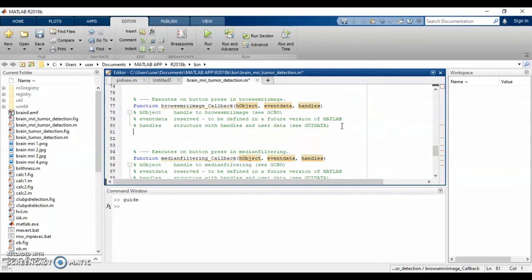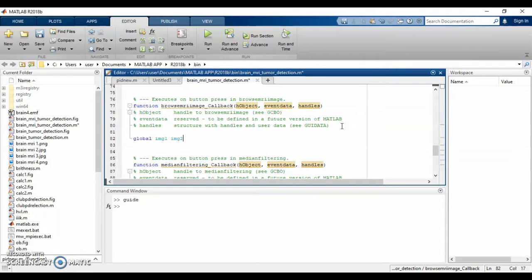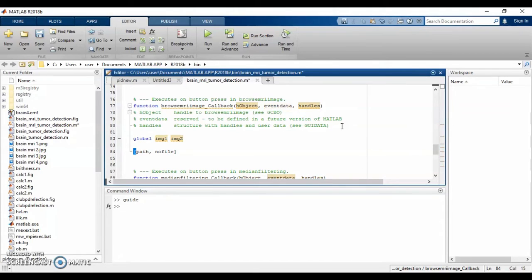We will create a function to browse MRI image, and we will use the command global so that we can share variable or images between function and command line. We will use the command imgetfile to retrieve image from our computer, and if the image is not available in the file, an instruction showing image not found will pop up from the window. And here is the command for this step.